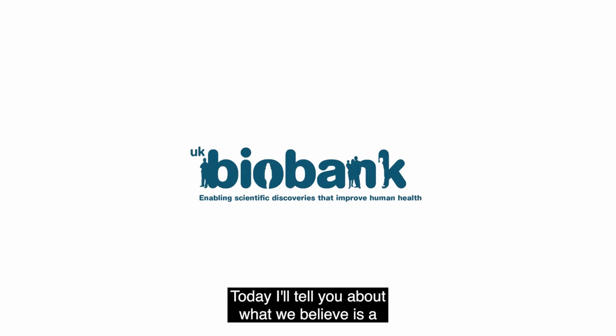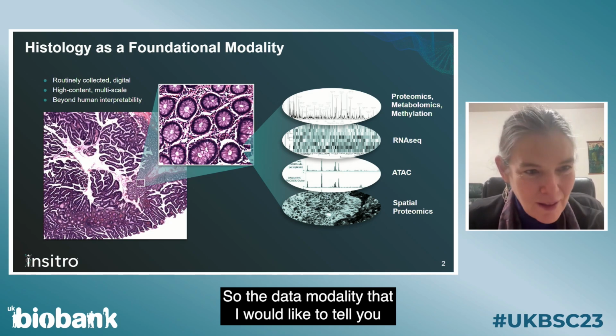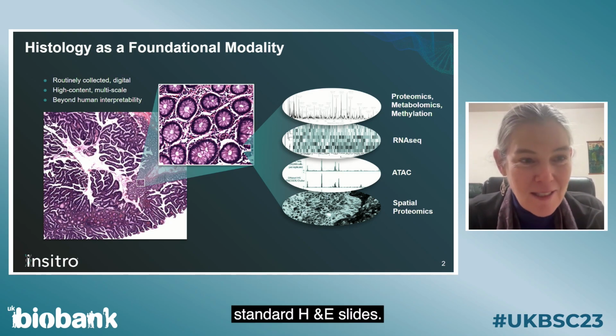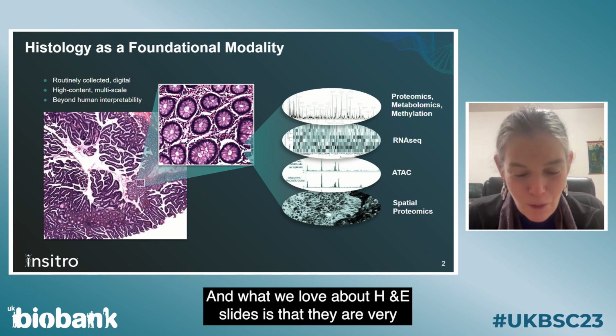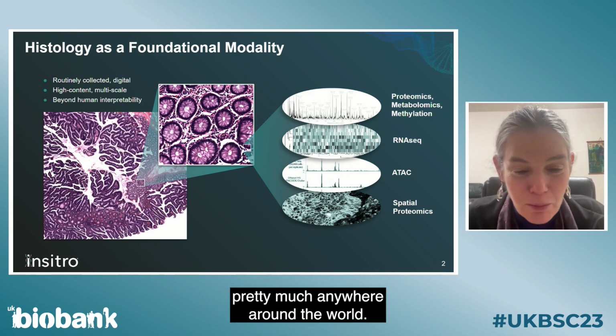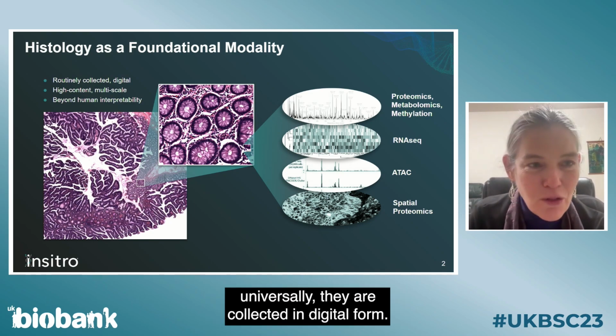Today, I'll tell you about what we believe is a tremendous opportunity for standard of care data in informing discovery. So the data modality that I would like to tell you about is histopathology, specifically your standard H&E slides. And what we love about H&E slides is that they are very much routinely collected from every solid tumor patient, pretty much anywhere around the world. And increasingly, although certainly far from universally, they are collected in digital form.